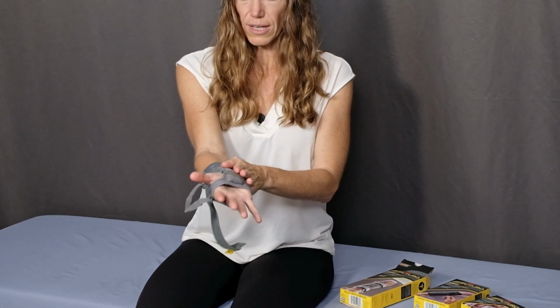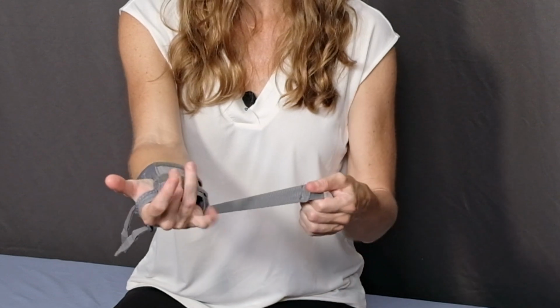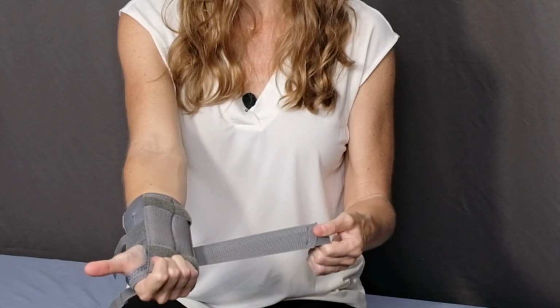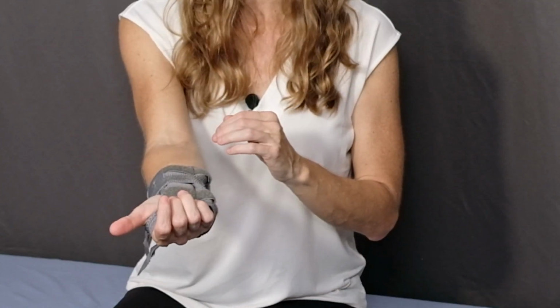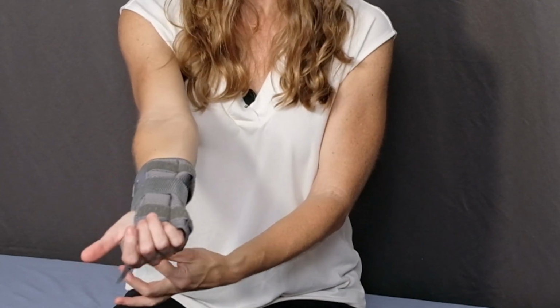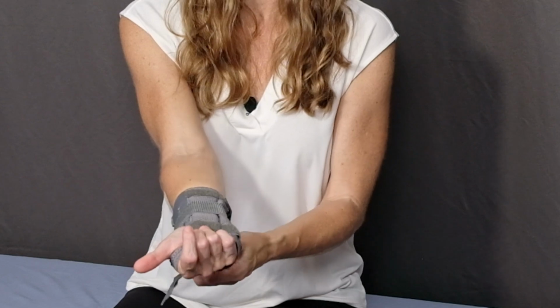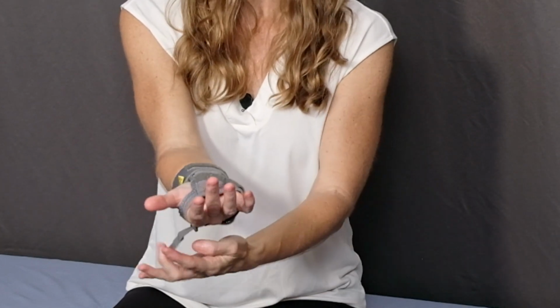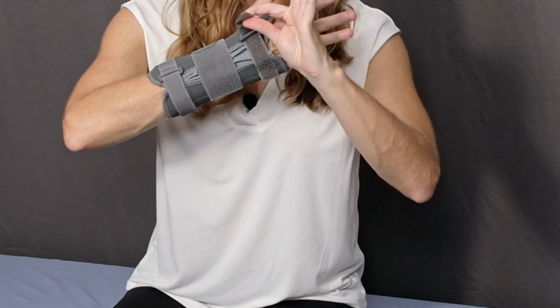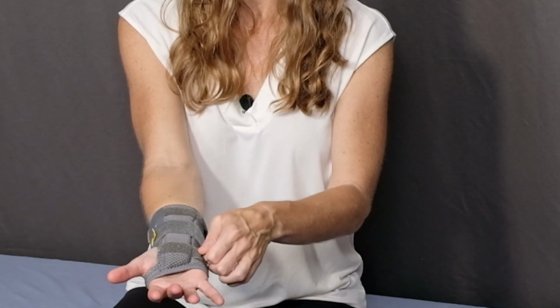All right, once that is in place, we'll start with the middle strap. I'm going to wrap the strap around. I can use my fingers here to help hold it in place. This should be snug but not tight. Now I'll pull this strap across, and I realize I've made the middle one too tight. I'm going to loosen it. Okay, that feels better. All right, and finally we'll do the strap across the back of the hand, wrapping it into the palm.